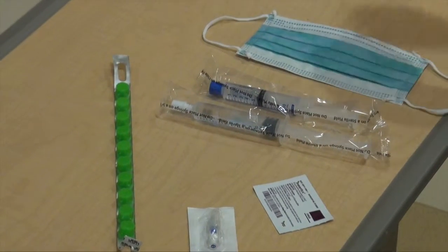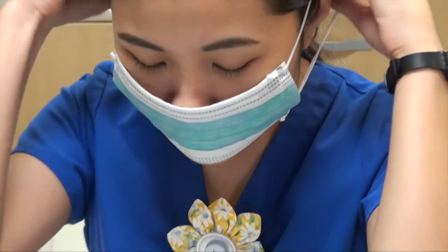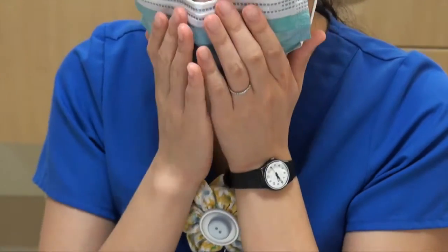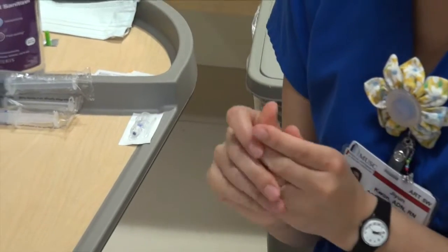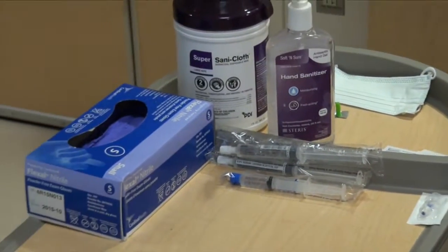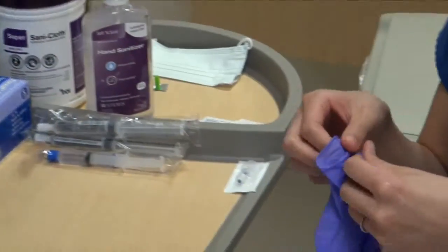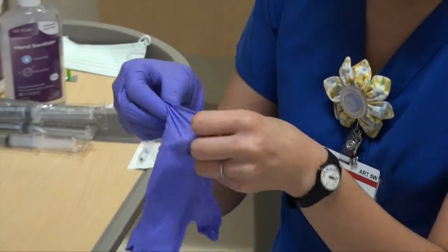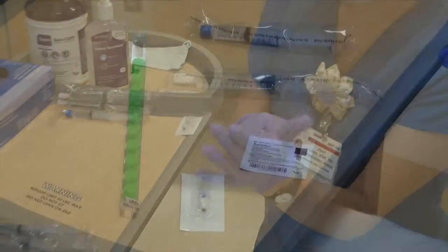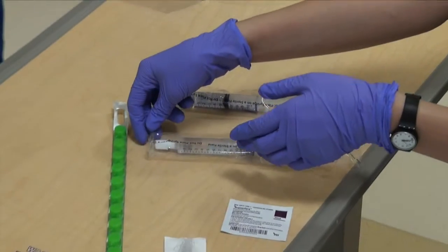Put a face mask on everyone within 3 feet of the open central line. Wash hands with soap and water for at least 30 seconds or hand sanitizer. Allow to dry. Put on clean gloves. Once you have your gloves on, get your supplies ready for the central line cap change.